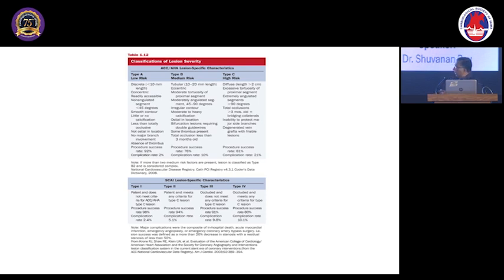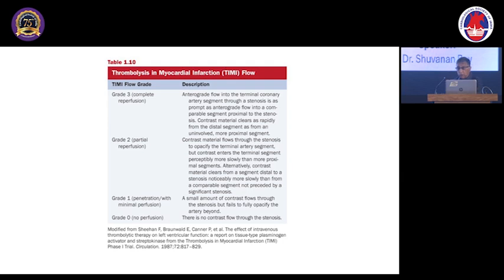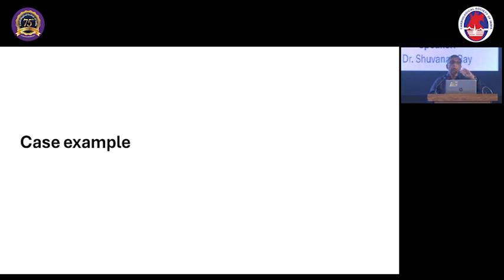And remember, the ostium of the LMCA is always a challenge, always a challenge. Do not expect to see the ostium of the left main in a LAO caudal view or any caudal view. No caudal view will show you the ostium of the LMCA. The ostium of the LMCA is better seen in cranial views. The cranial angle can range from 10 degrees to 30 degrees, but it is better seen in a cranial view.